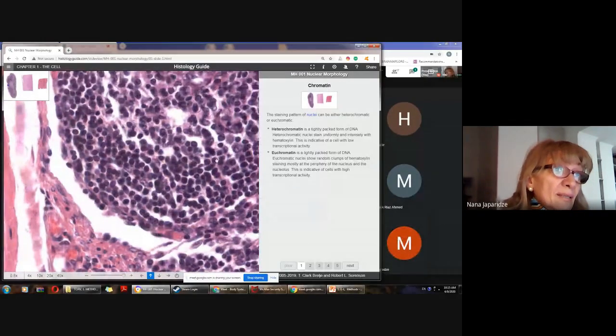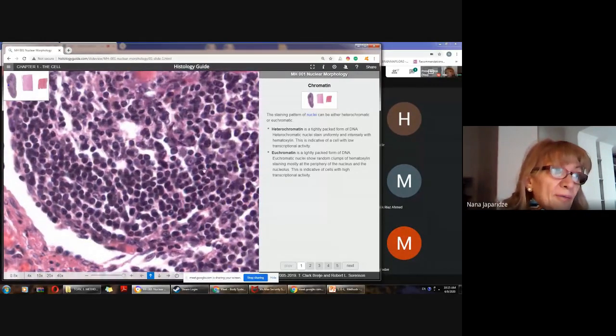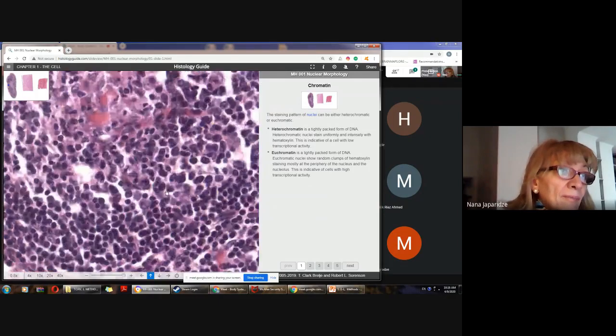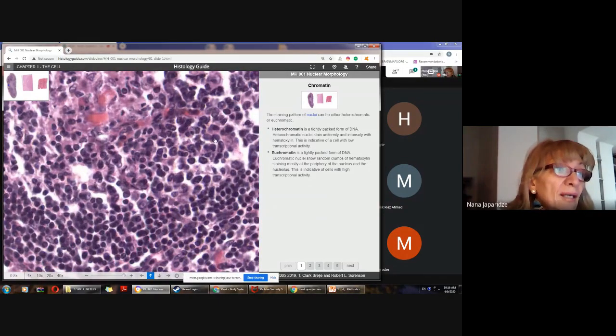Look, this is parenchyma of the node, lymph node. So what we see here are different types of cells, and nuclei are very well visible. Look, these dark stained dots, all of them, they are nuclei. Look, dark stained nuclei, which are surrounded with a thin rim of cytoplasm.